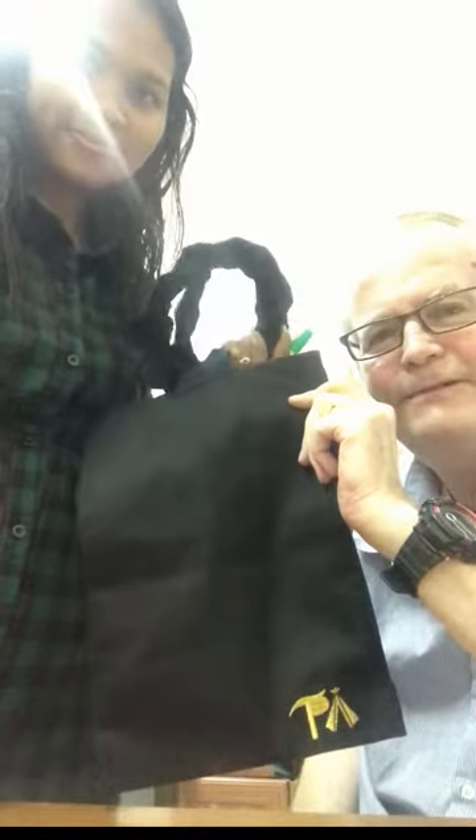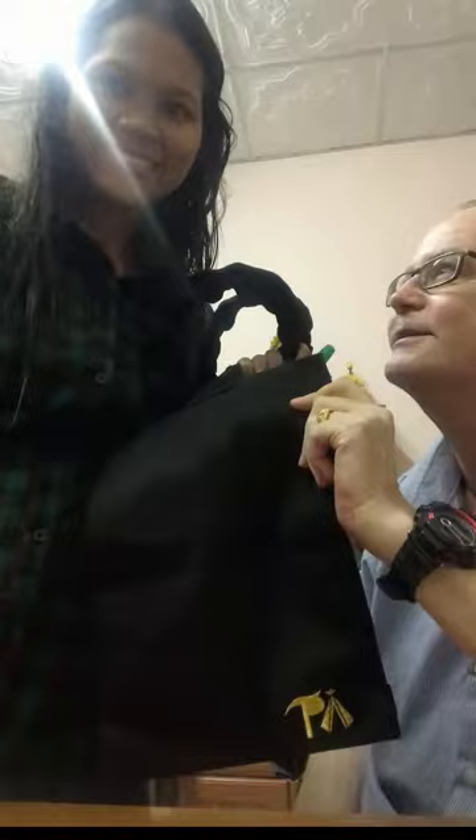So here we have a heavy duty, smart 100% cotton catheter bag cover, which I hope serves you very well. Thank you very much for watching — it's goodbye from me, Steve, and it's goodbye from May. Bye!